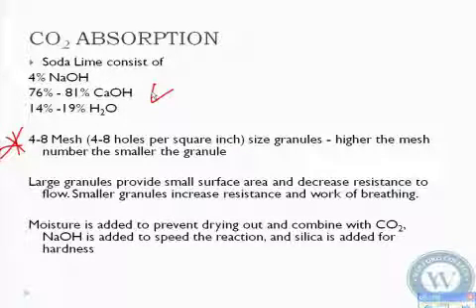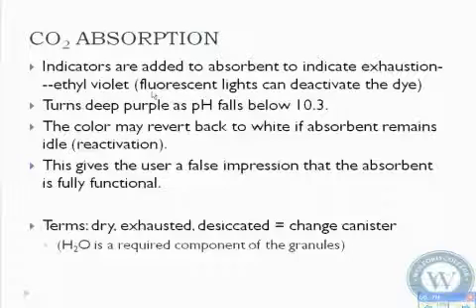All right? And then the small amount of water, that 15% of water or so, is added to prevent drying out. The water combines with CO2. And then the sodium hydroxide is added to speed the reaction. And then any hardener, silica, or calcium sulfate is added for hardness.